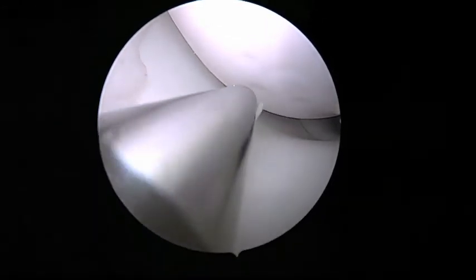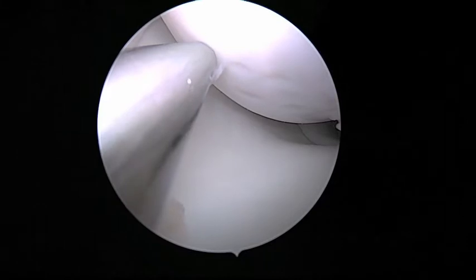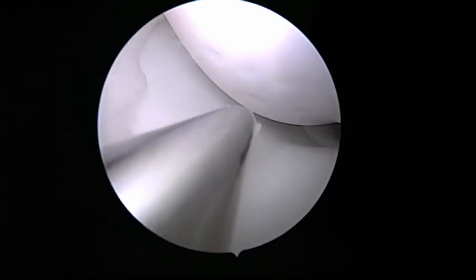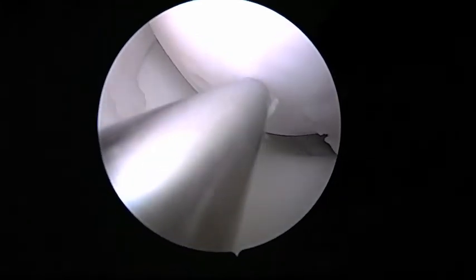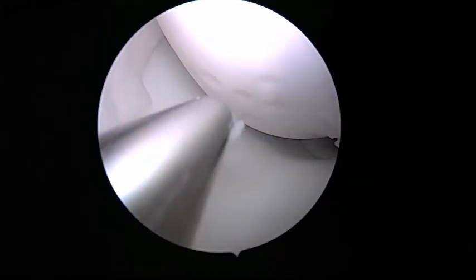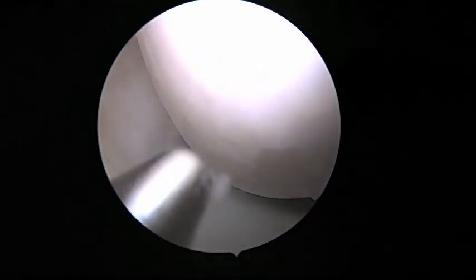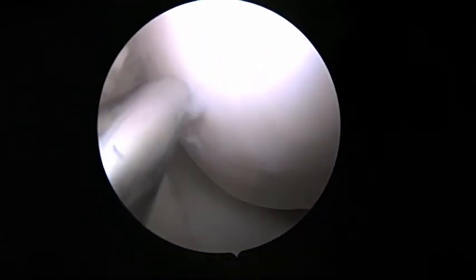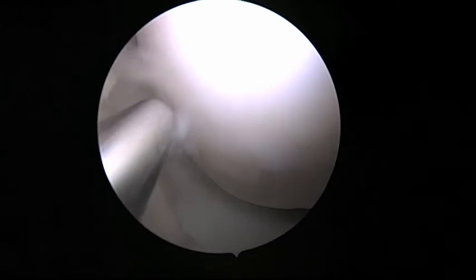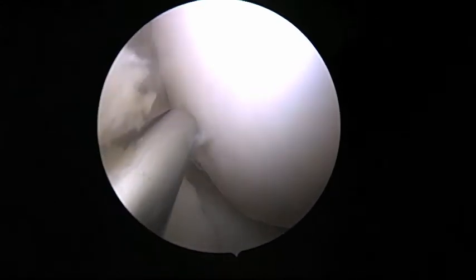The view is obtained via an anterolateral knee portal, with the knee flexed to approximately 90 degrees. A Dyonics blunt trocar is inserted through an anteromedial portal.